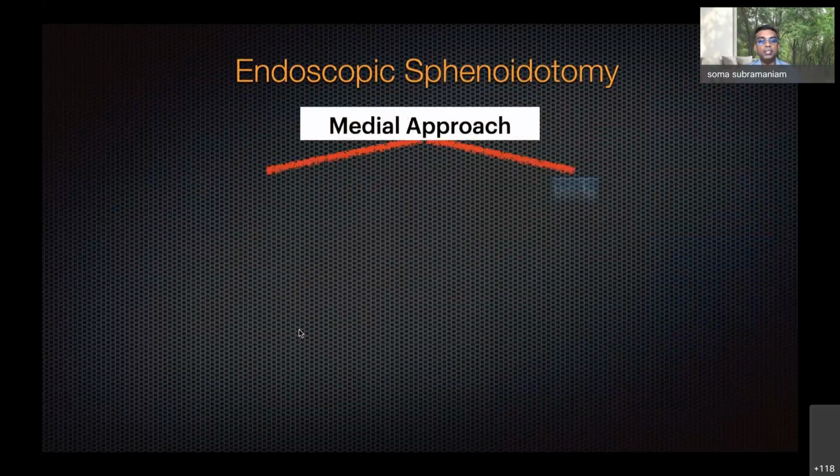When I think about the medial approach, I think about two types, either a narrow or a wide approach.